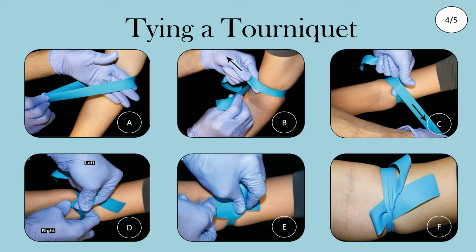When the straps are facing the hand, they can get in the way of the actual IV insertion. You want those straps facing the head of the patient.